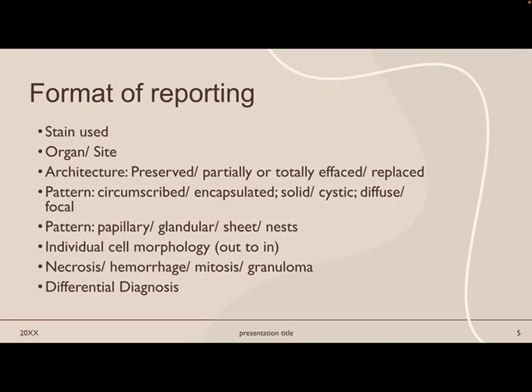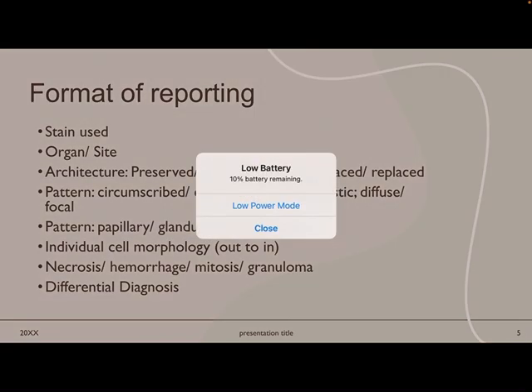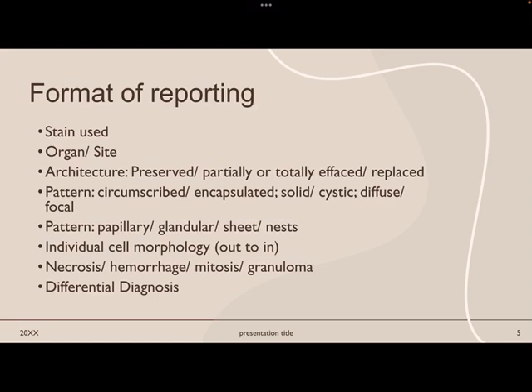And then you come to the other things which are especially important in tumor cases: whether there is necrosis, whether there is hemorrhage, and tell about the mitosis. And then you tell whether there is presence of granuloma or not. And then you have to write a differential diagnosis.